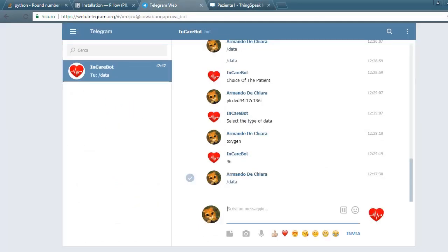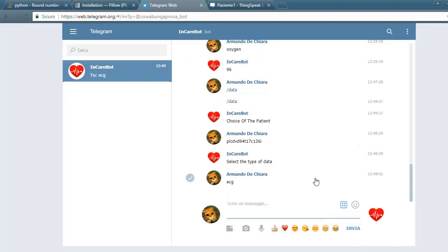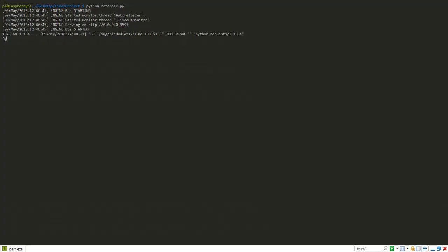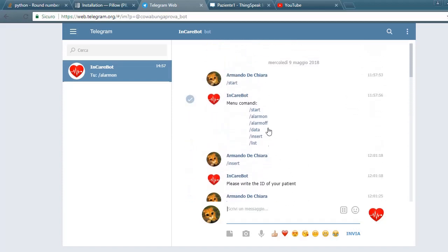It is also possible to retrieve the last ECG record of the patient. As always, we select data, the patient, and then ECG, and the Telegram returns the image. The image is this one, and as we can see, this is all noisy due to problems for the measurement, but it is the last ECG record. Here, the image database receives the request from the Telegram and sends back the image. The last two commands are alarm on and alarm off. By pressing alarm on, it gives the possibility of receiving alarms, while by pressing alarm off, this function gets suspended.